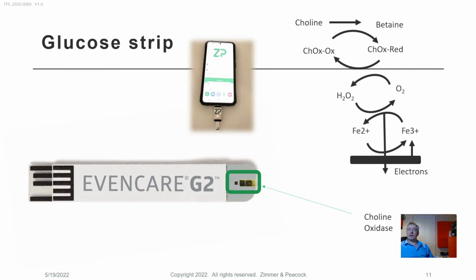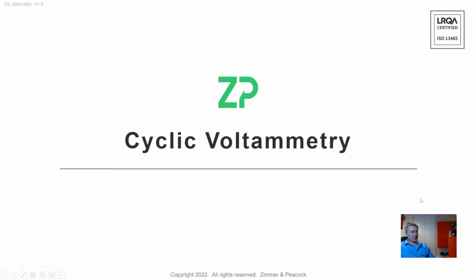But the manufacturers set these glucose meters up so they have a very definite way of working. And when you start interfering with the solutions on board, it will detect that, think there's been a manufacturing error or some sort of sample error and throw an error, and you won't get a result. But that said, you can always try it, of course. It's not that hard to try it.